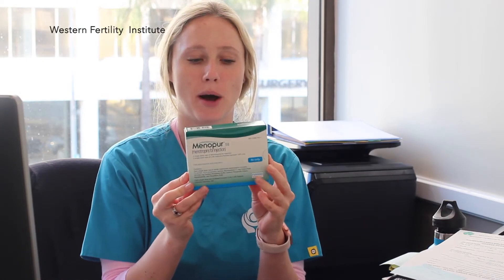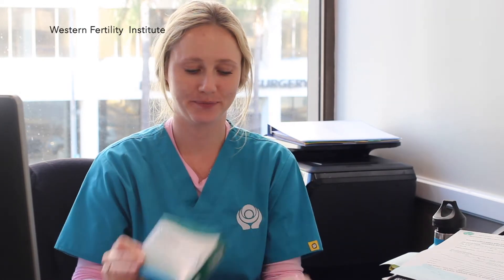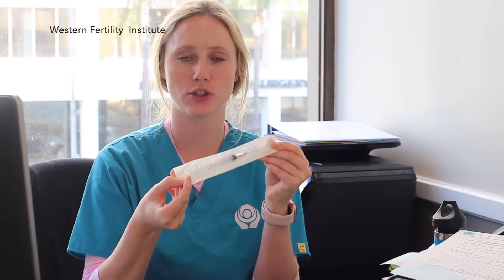When drawing up Menopur, you're first going to get your medication. The box should say Menopur on it. The second thing you're going to need is your syringe. We're going to use the 3ml syringe.